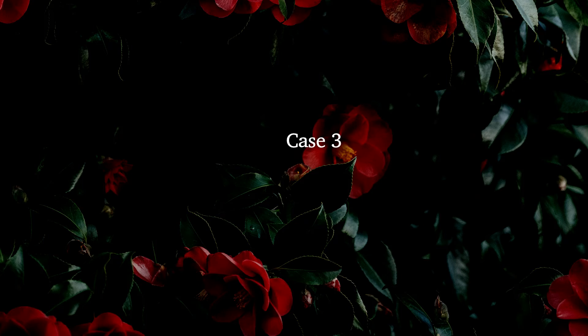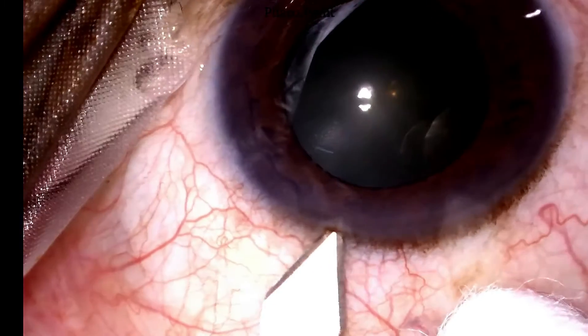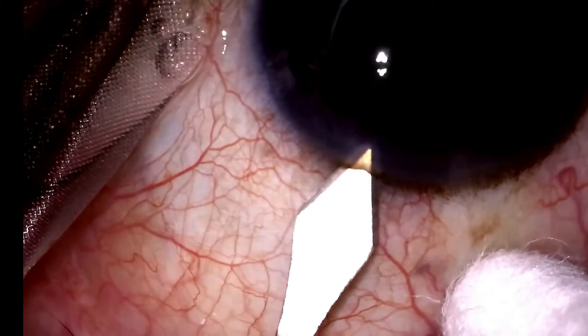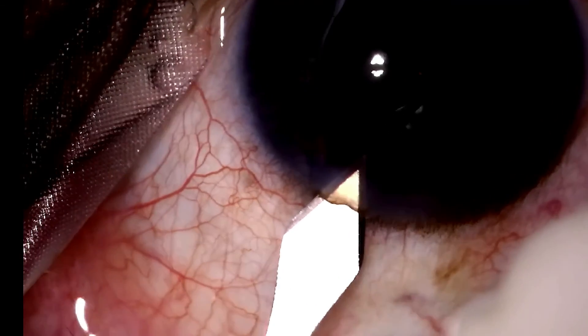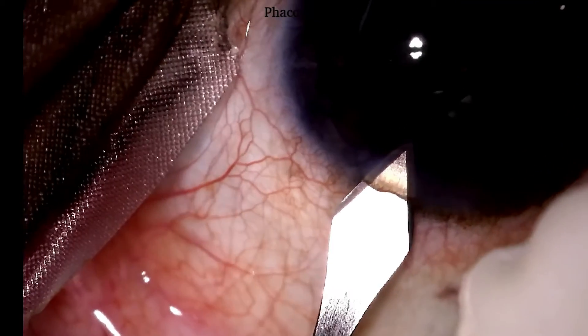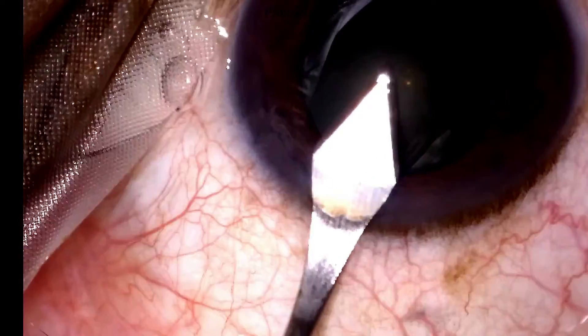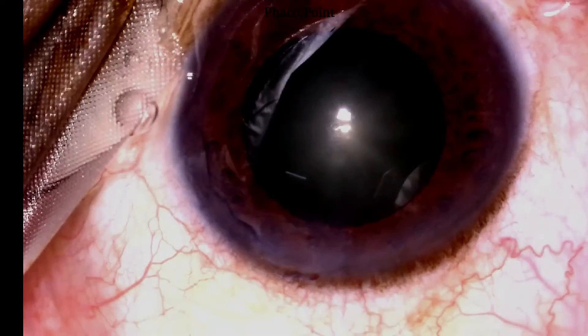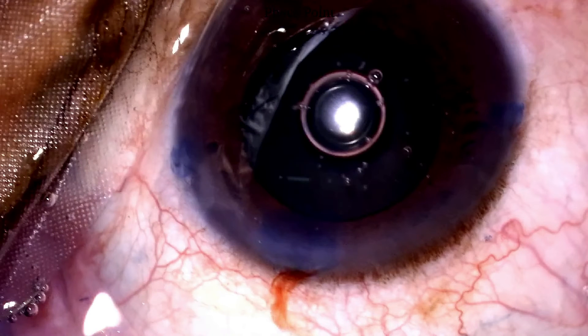Let's now look at the clear corneal tunnel made by the other keratome. In this particular case, note that the starting point is at the limbus. The tunnel thus created is a 2.8mm by about 2mm tunnel. With the use of these blades you are able to create a pretty decent tunnel, but my personal preference is for the orange blades — the ones with the parallel shaft proximal to the shoulder.